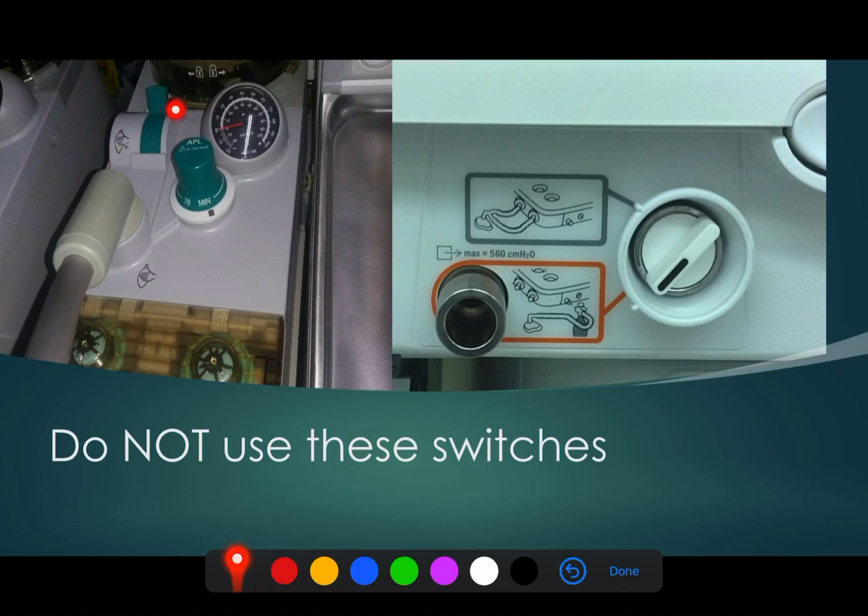This can be used as a substitute for a water circuit, and that's how we use it in anaesthesia. But again, if you're having to bag patients, I would speak to the physiotherapist, the intensive care doctor, or the anaesthetist, and they'll be able to help you. But for day-to-day, I would not touch this.